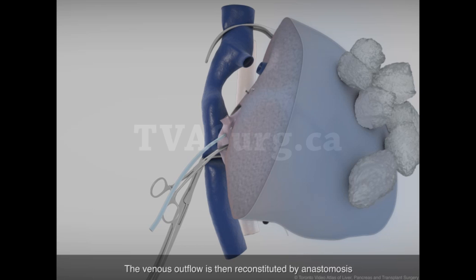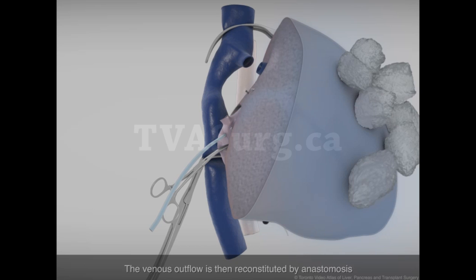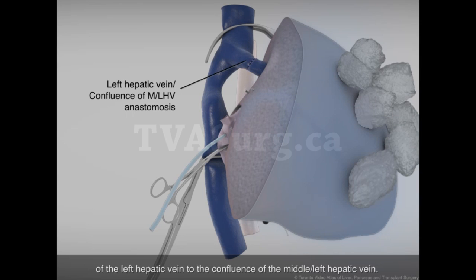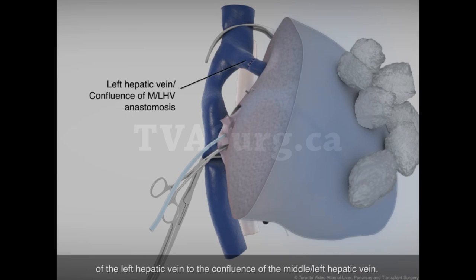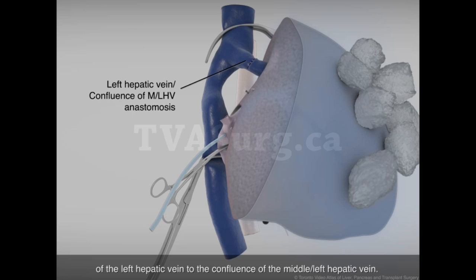The venous outflow is then reconstituted by anastomosis of the left hepatic vein to the confluence of the middle left hepatic vein.